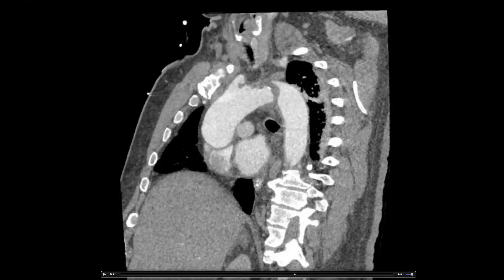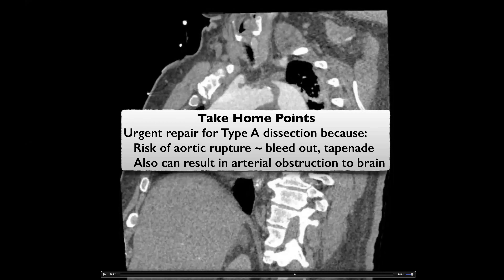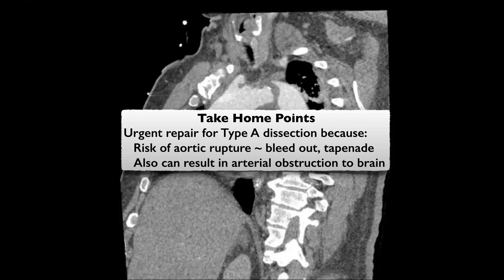Type A dissection, by virtue of involving the ascending aorta, requires urgent repair. This is because of the increased risk of aortic rupture leading to exsanguination or cardiac pericardial tamponade, but also because it can result in arterial obstruction to the brain, as in this case — for which unfortunately nothing could be done.